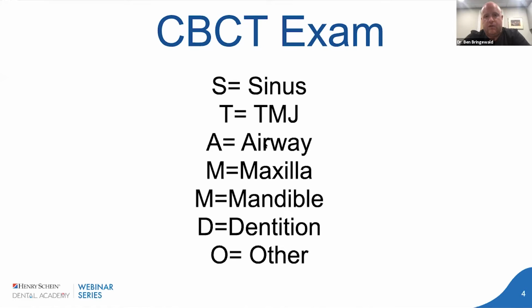So when you buy your CBCT, either if it's an Orthophos through Dentsply Sirona or if it's an Axeos, one of the things that comes with that was a voucher for a course through CDOCS. And they have two great facilities. One is in Arizona, one is in Charlotte. The teachers are great, the facilities are great.